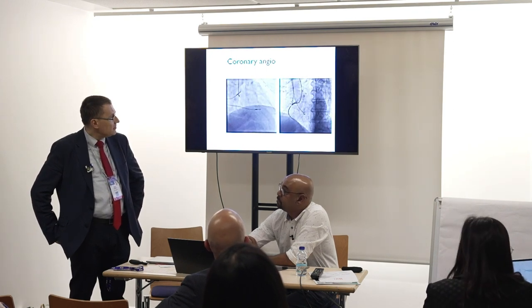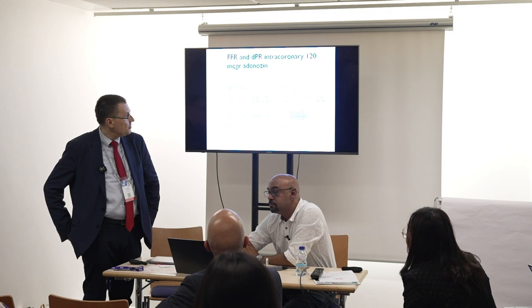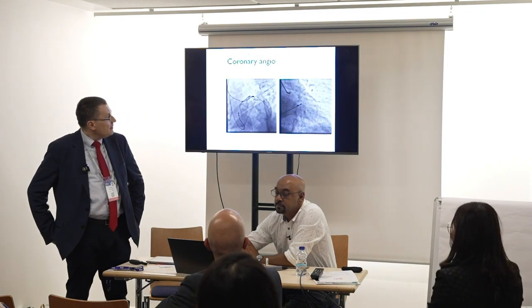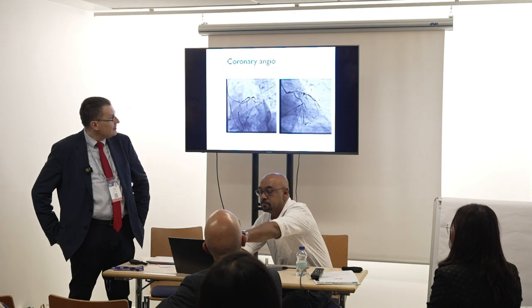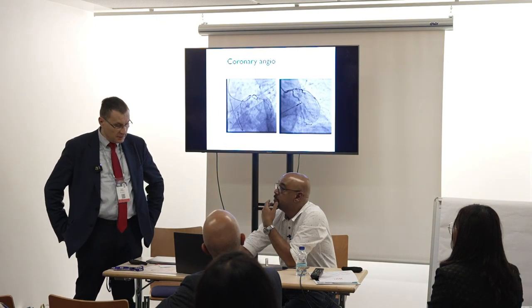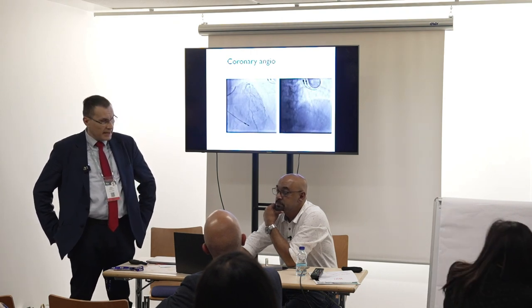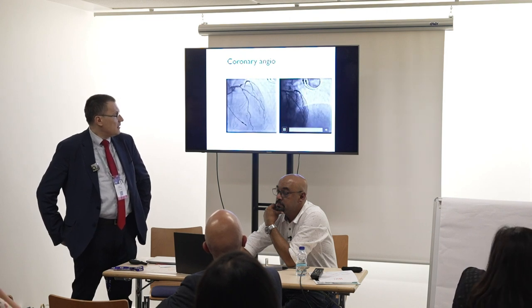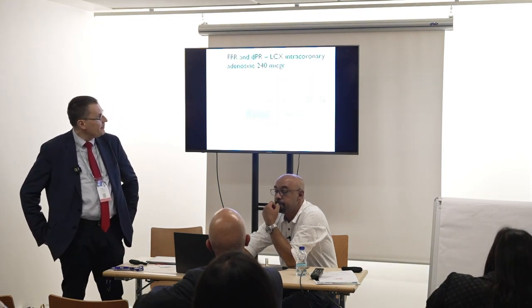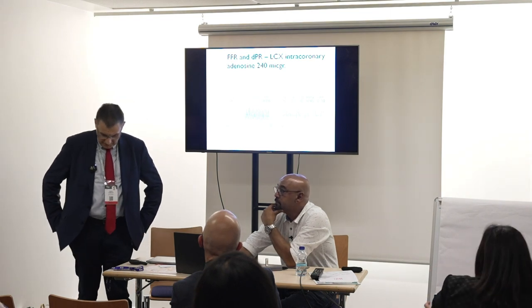This is how the right coronary looks, and we made an FFR here, and it was non-significant. The non-hyperemic ratio was clearly 1, and FFR was 0.94. There was a haziness at the ostium of the circumflex with an eccentric lesion at the very ostium of the circumflex. And there was also a tight lesion on the LAD. As you see, this is Medina 111 with an aneurysm at the tip of the carina of the bifurcation, which potentially could make wiring of this diagonal difficult. We made first FFR in the circumflex, and it was pretty clear that this lesion was non-significant.